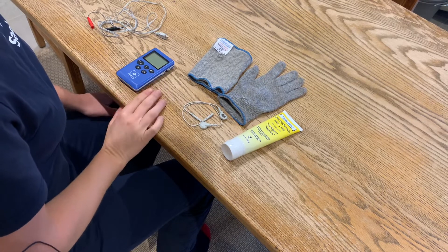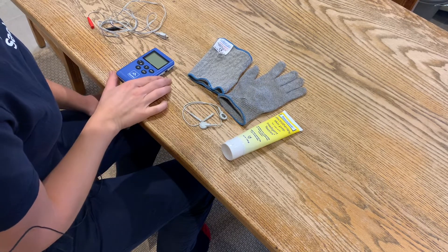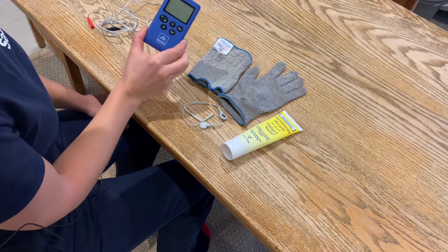In this video I'm going to take you through setting up your sensory electrical stimulation program on the Sabo Stim Pro.